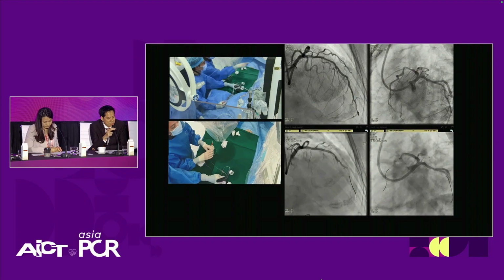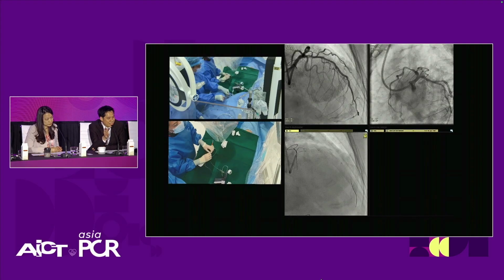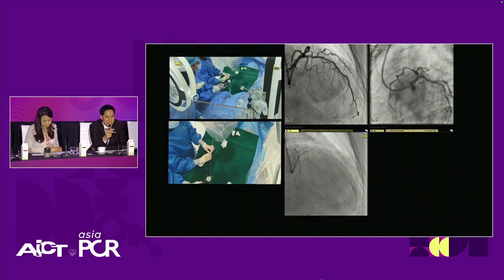Basically I match the vessel, but you don't go too high because DCB is not the way you prep the lesion. It's just the balloon that you deliver the drugs. Yes, I would choose the same thing.